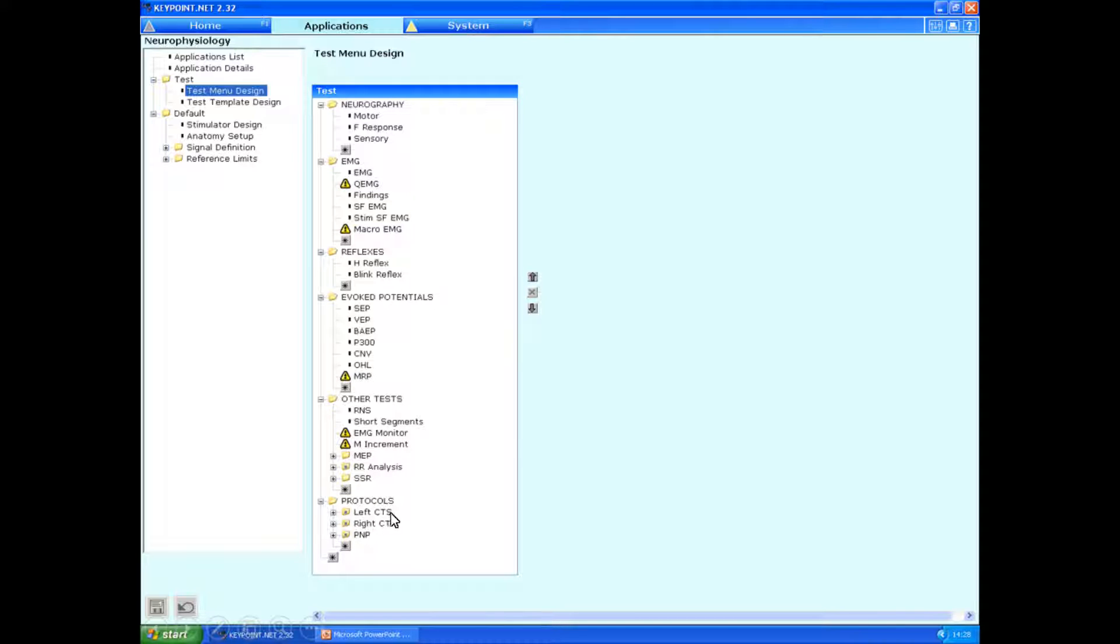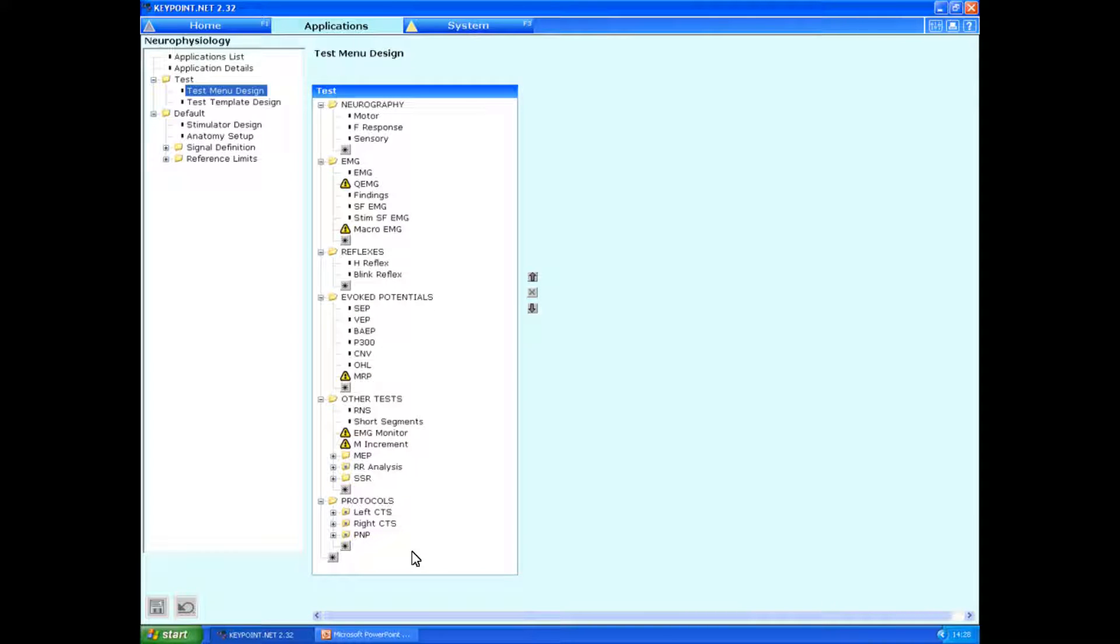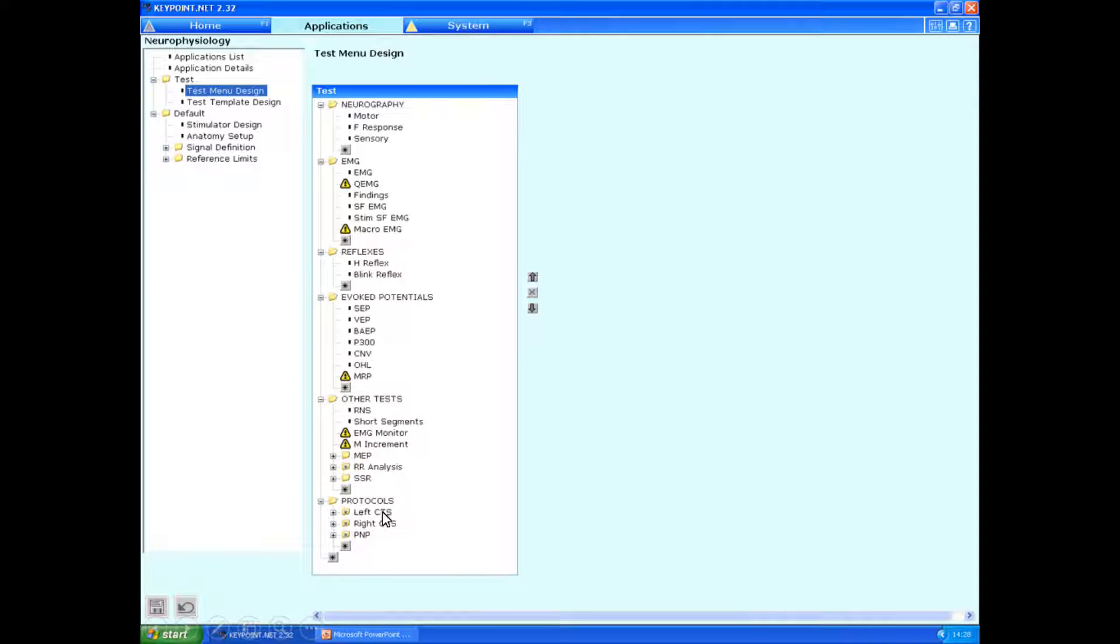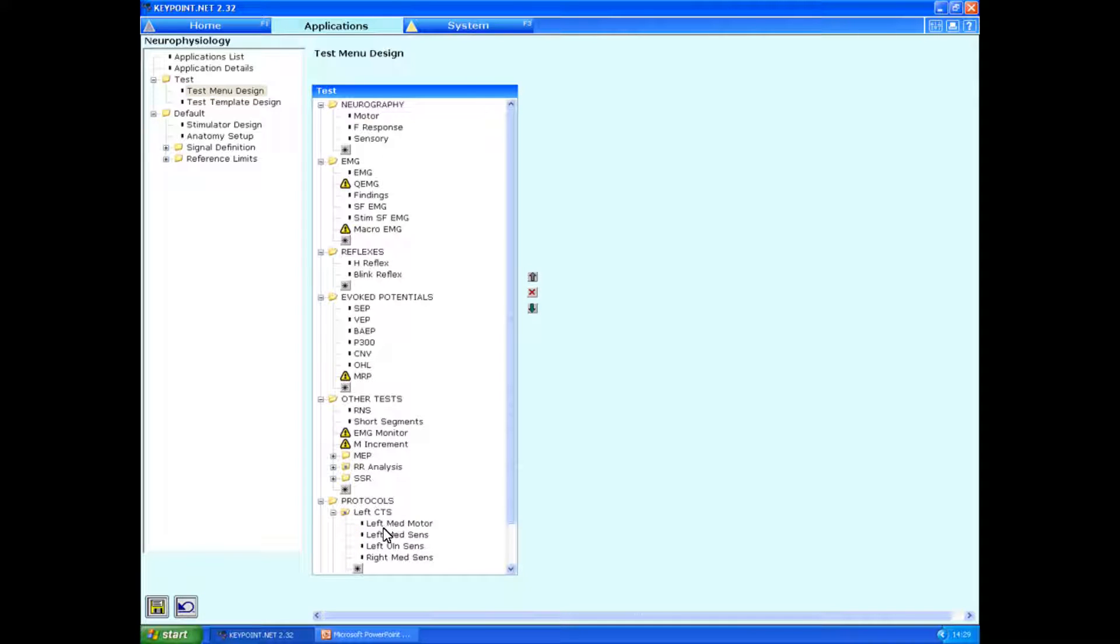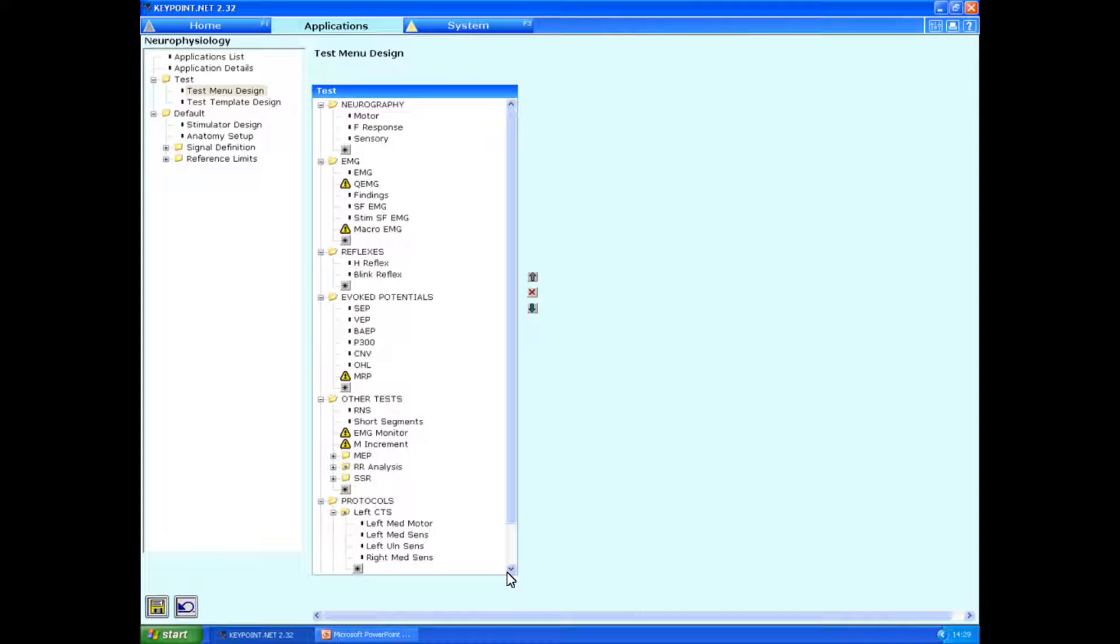A number of protocols are set up as standard, but we're going to show you how to do this from scratch. It's important to note that whichever way you leave the menu design bar in the design stage is how you're going to see it when you're actually using the program. So, for example, if you just click on left CTS here, all these sensory and motor studies come up. And that's how you're going to see it fully expanded in the final version. So it's important if you want to keep a tidy page to make sure you minimize things afterwards.